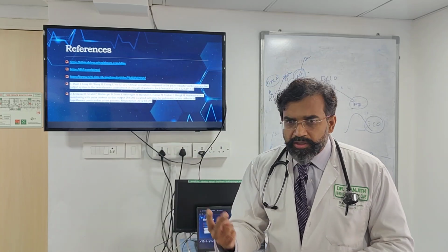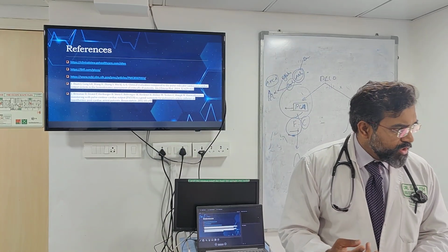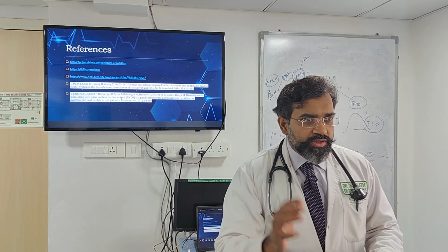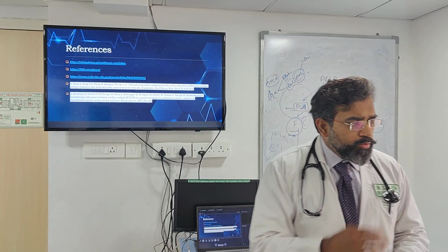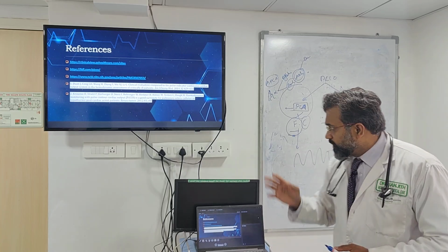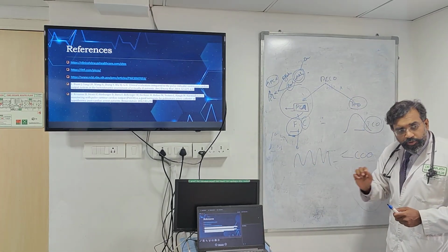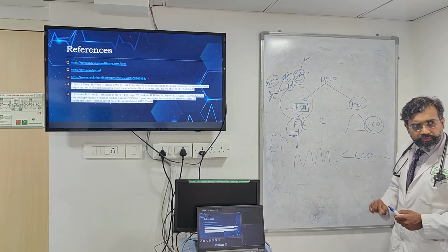Clear on this? So two different technologies, right? One technology is the gold standard. The other is looking at the gold standard and telling you what the actual cardiac output is. Now, Amit, if I would ask you, looking at this, when do you think we should repeat thermodilution?